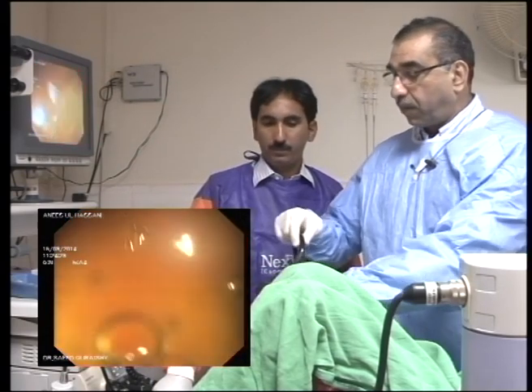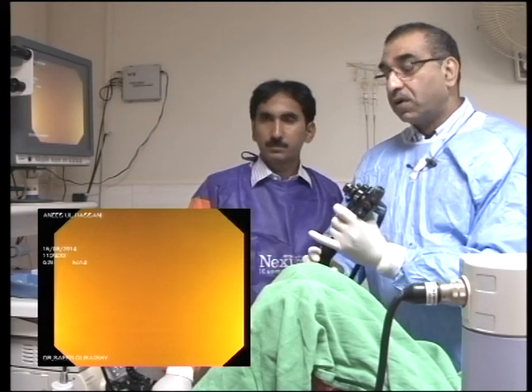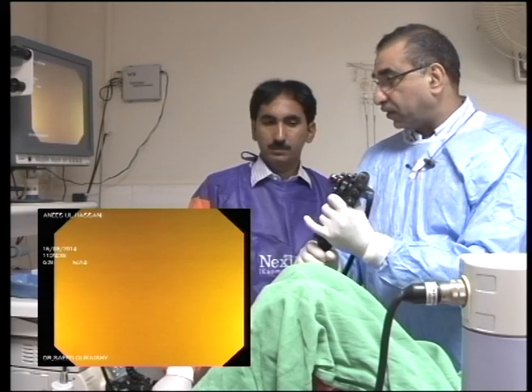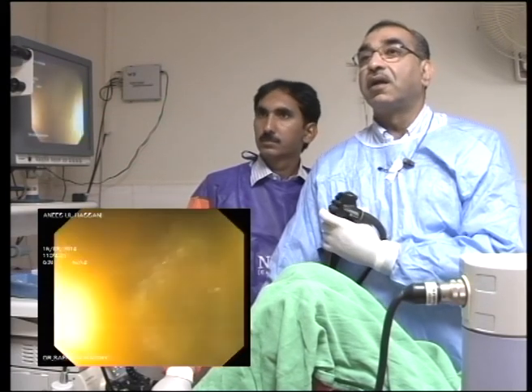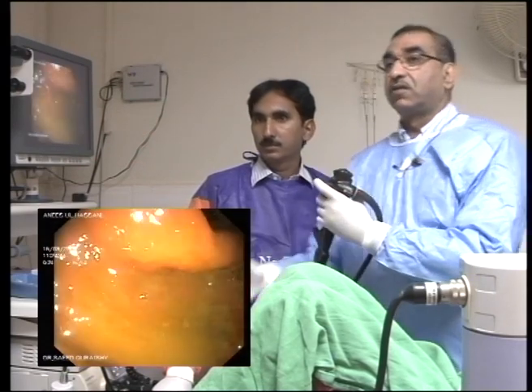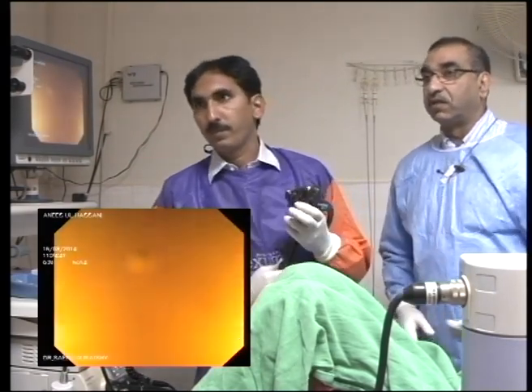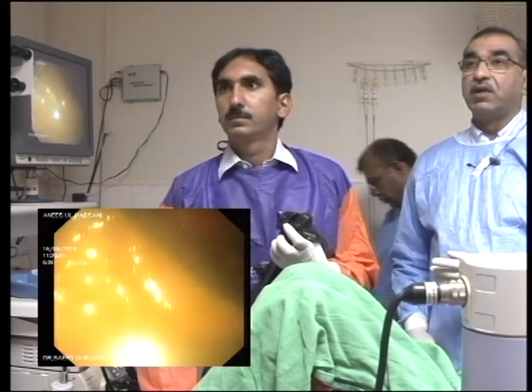Now what you do is clear up all your loops. Make the scope nice and comfortable for you. Unstiffen the scope so it's nice and maneuverable, right? And then inspect as you come out. You don't have to clear all the feces, but keep the lumen in full view, and then we'll see.